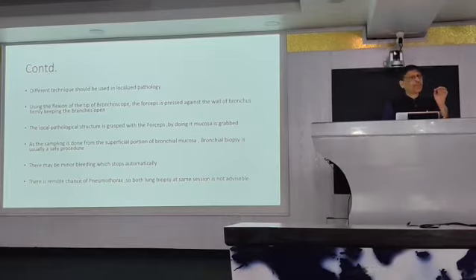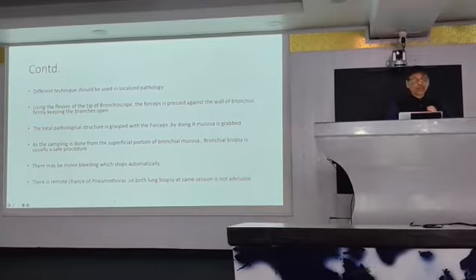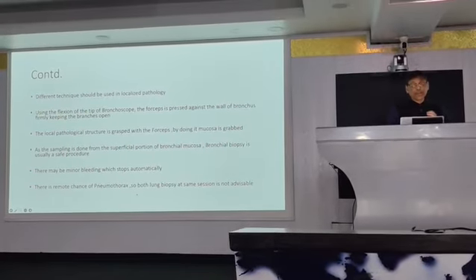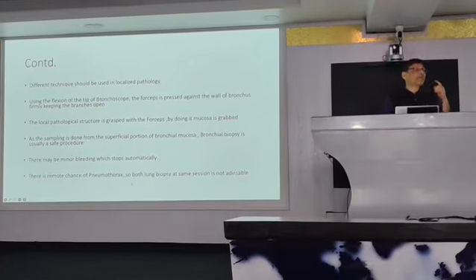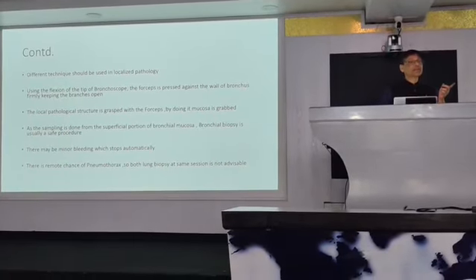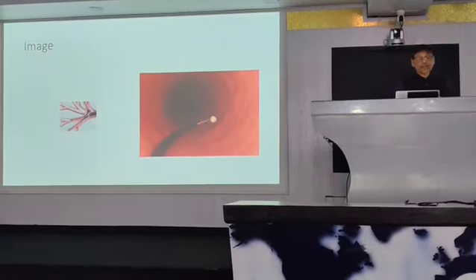Just give time, just be there with your scope. Observe it. There is a remote chance of pneumothorax, so biopsy of both lungs in the same session is not advisable. Do not take biopsy from both lungs in the same sitting, because there will be bilateral pneumothorax. It will be more dangerous.